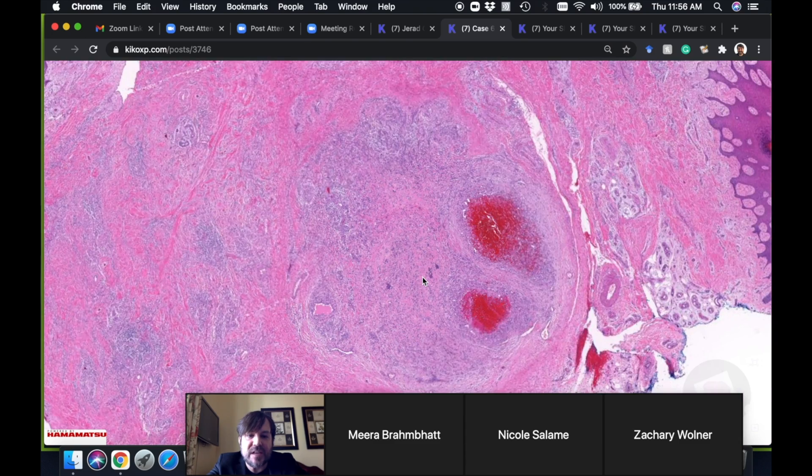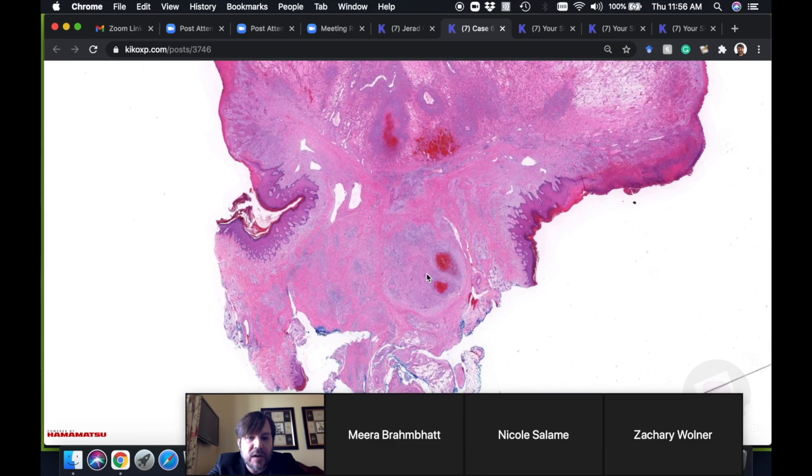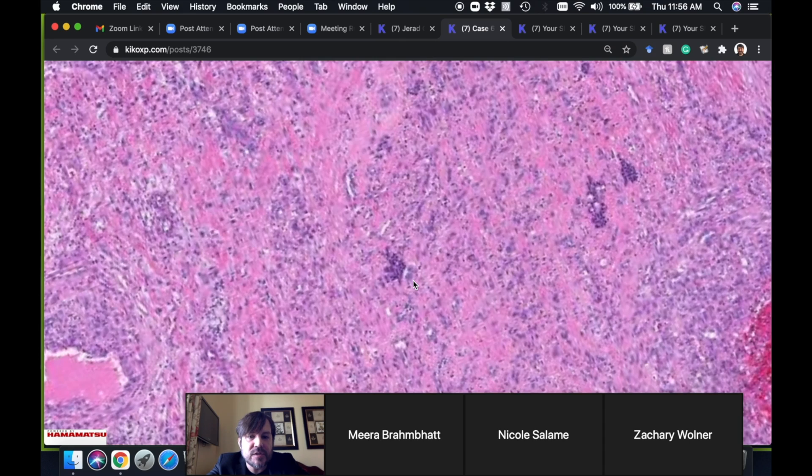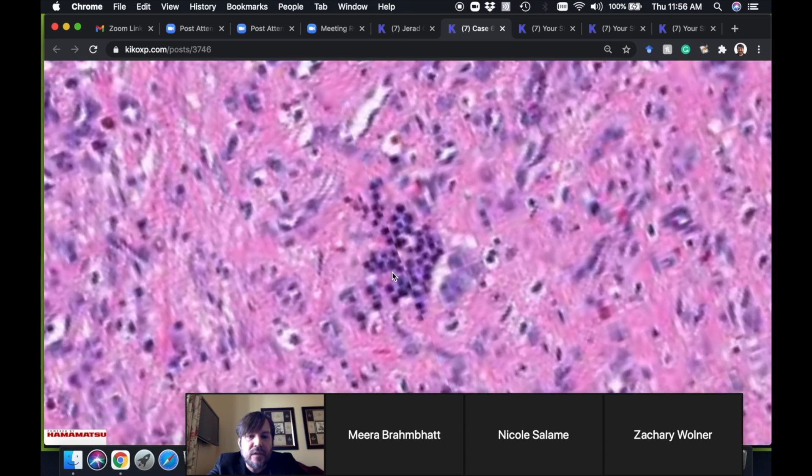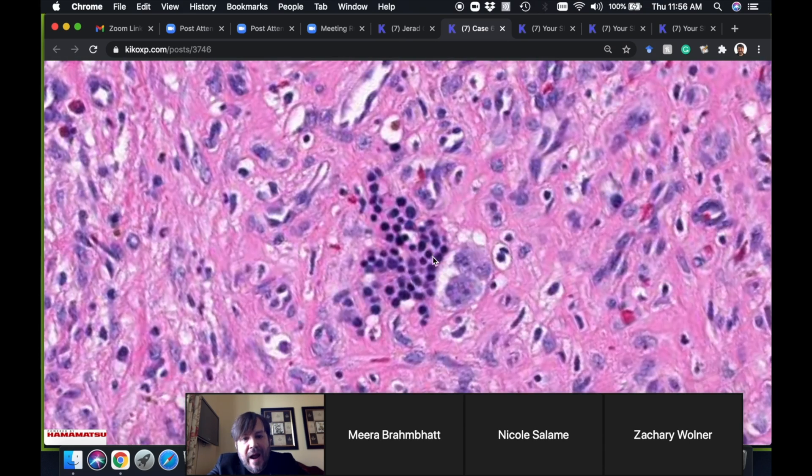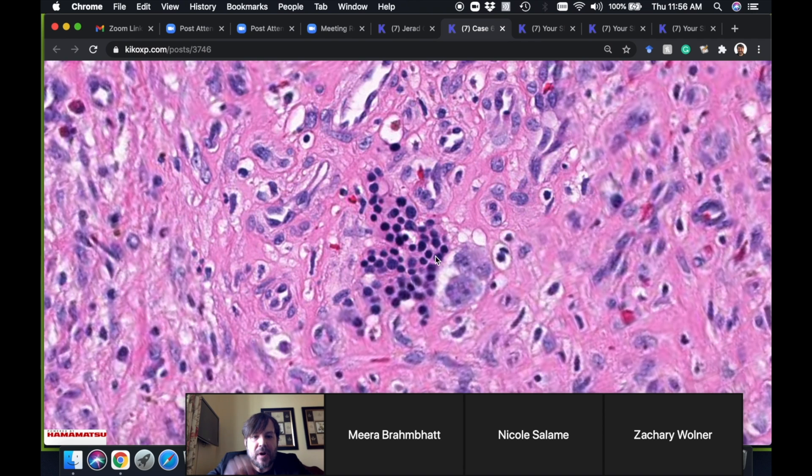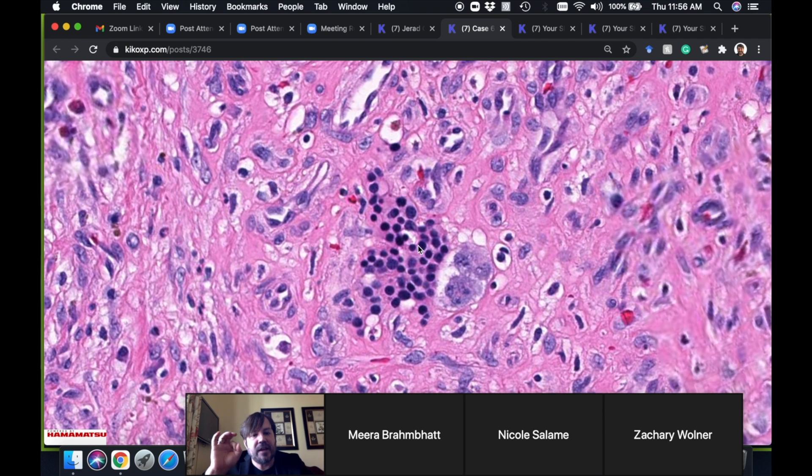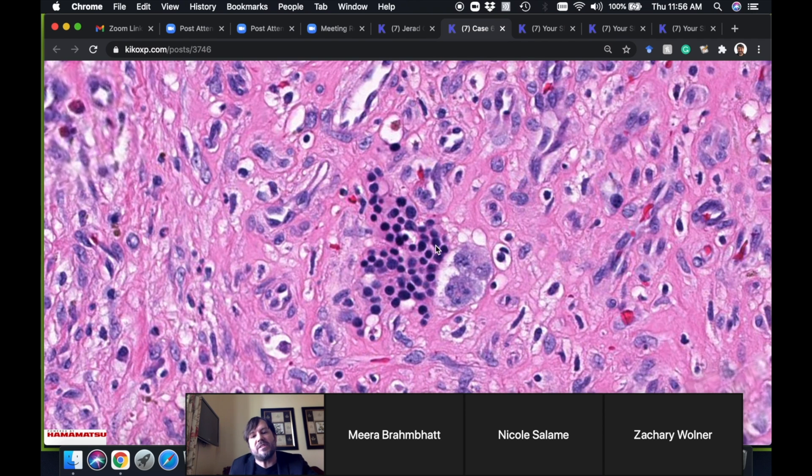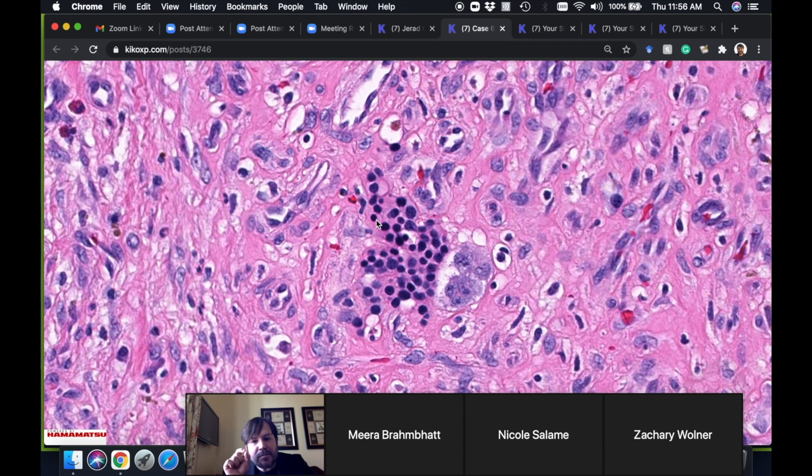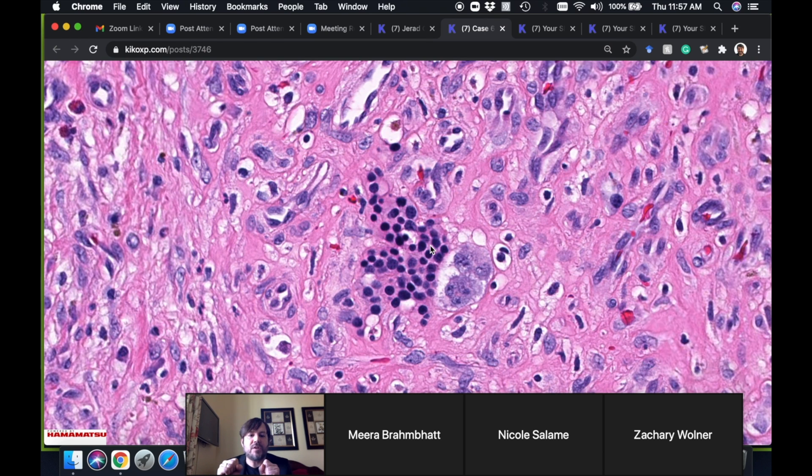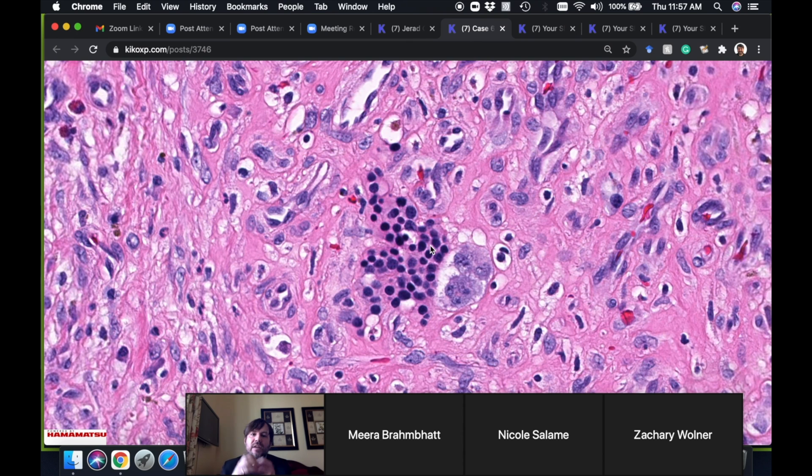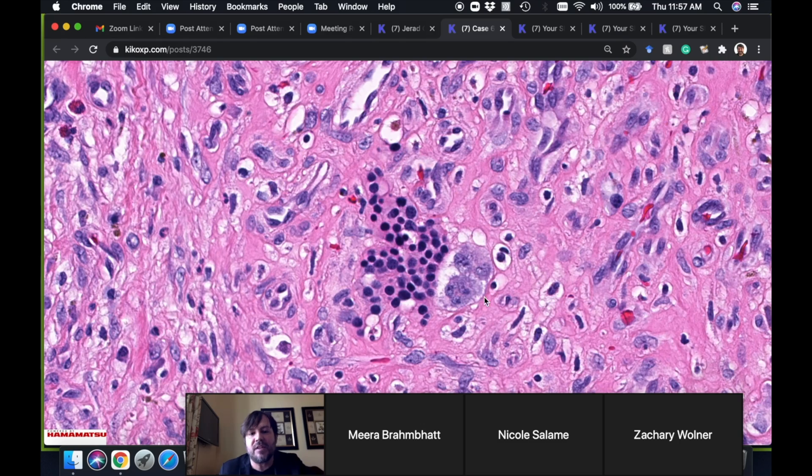Are there some nucleated red cells down there? There you go. It's cool because you can see them even from low power—you can see these dark little areas there. When we go close, you can see these guys here. They are round and super hyperchromatic, really dark, almost like they're dark like lymphocytes. But as opposed to lymphocytes, they're even more perfectly round and they're little tiny ones, medium ones, and bigger ones. I find that that feature—perfectly round, really dark cells, kind of like lymphs but a varying size, cluster together—erythrocyte precursors.